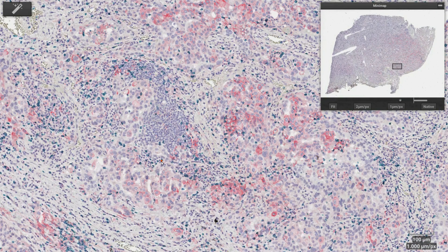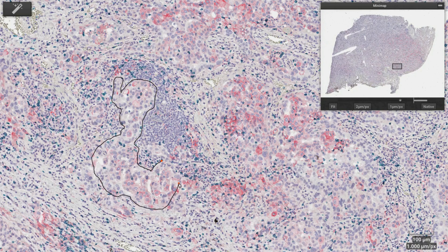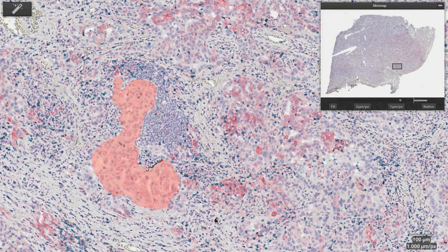When there are cells that have not been classified properly, the regions with those misclassified cells are just added to the training. This is an interactive and iterative workflow until the cells on the whole slide have been classified properly. This way, the expertise of a pathologist is used in the most effective way for each patient, providing the highest quality of data.